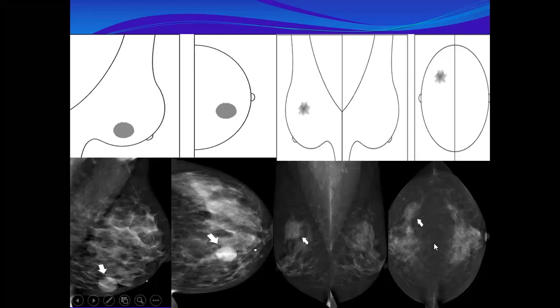But if you look, the shape is not a persisting shape as we described before. This very small area looks like a convex, otherwise it has a concave. A mass should not have concave borders. There is a concave, and you can see part of the fatty tissue going slightly into the borders of the lesion, not very clear, not in depth.